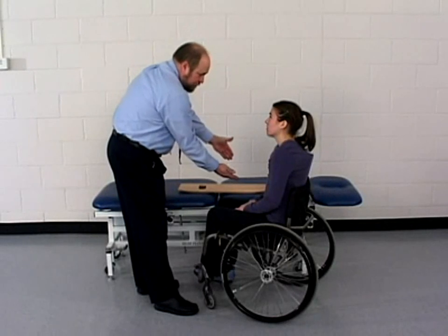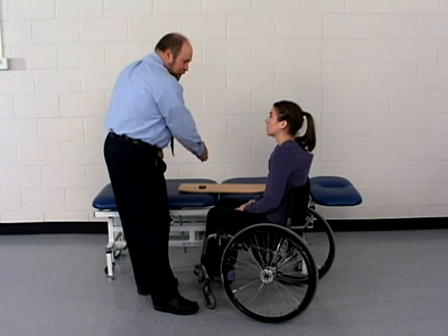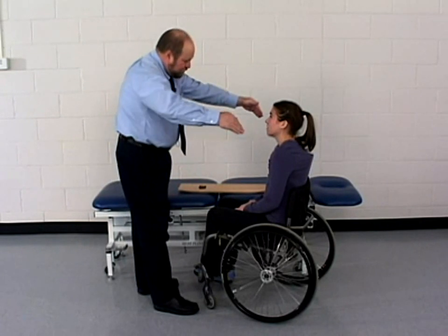A sliding board transfer may be utilized when a patient has sufficient strength to lift most of the weight off her buttocks and is balanced enough to move in the sitting position.